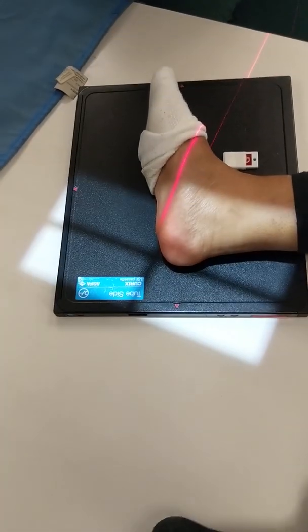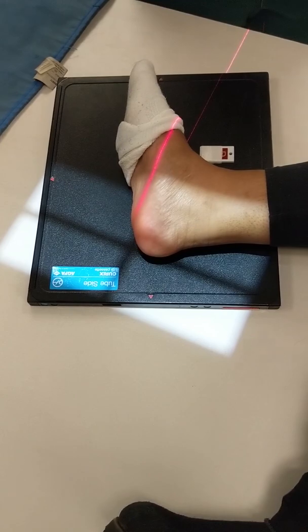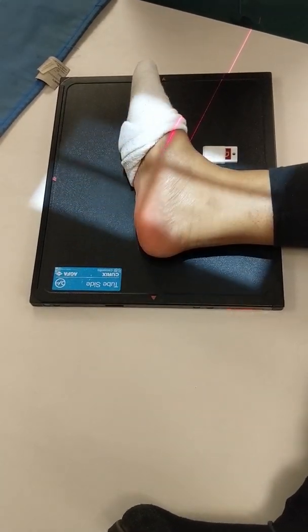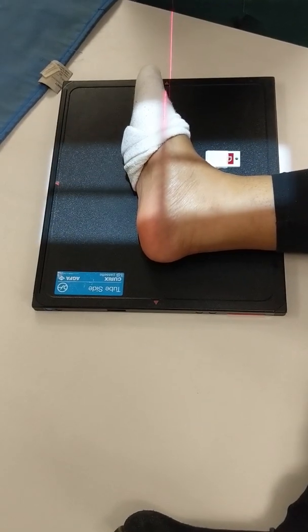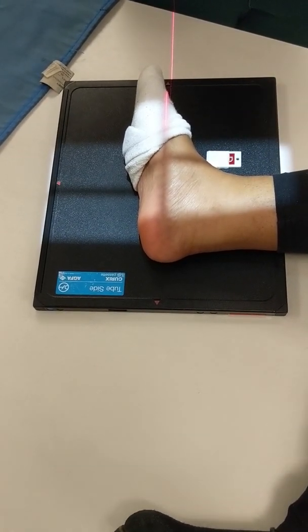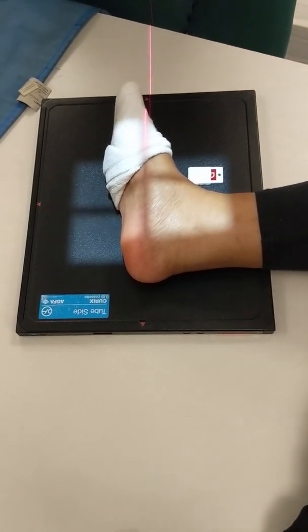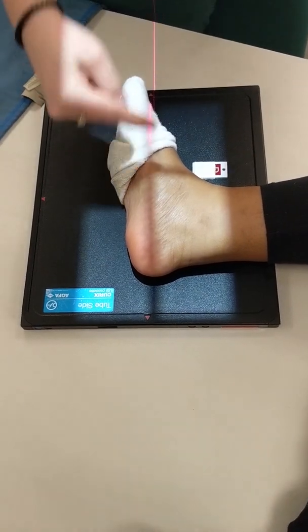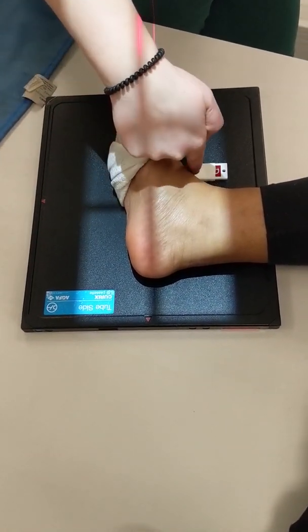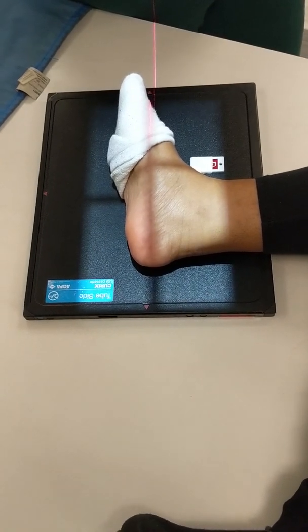Okay, we still have a 40-inch SID, and this time where are we centering? Malleoli. We are looking at the foot still. So actually, this one is going to be at the medial cuneiform. Good. So the medial cuneiform is here, and it's at the level of the base of the third metatarsal. I am going to center up just a little bit more.